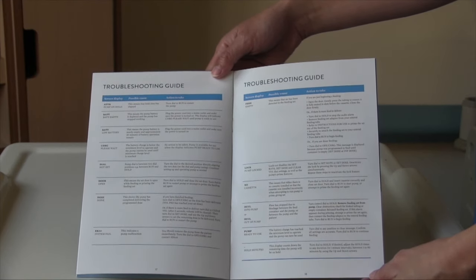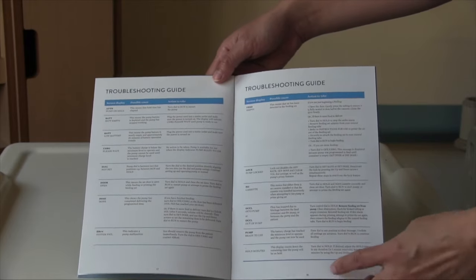There is a complete troubleshooting guide in your training manual on pages 17 and 18.